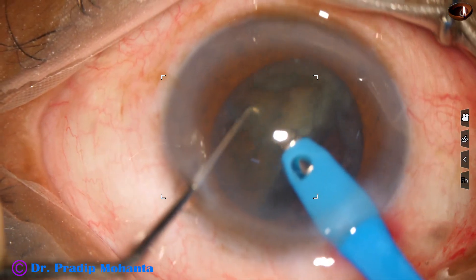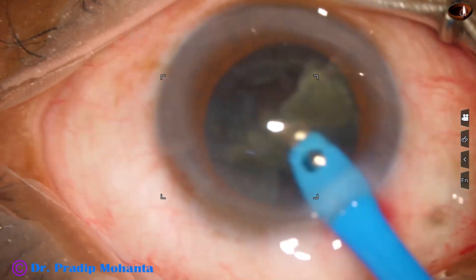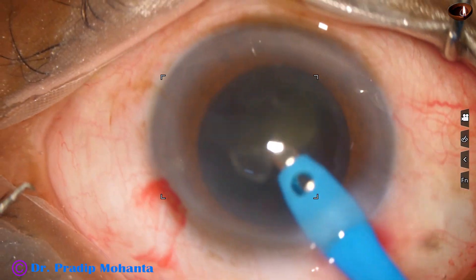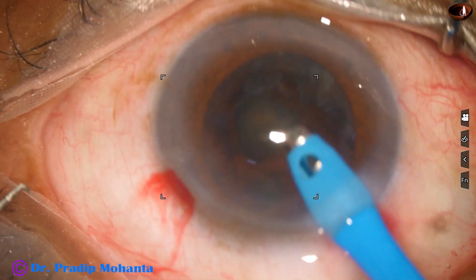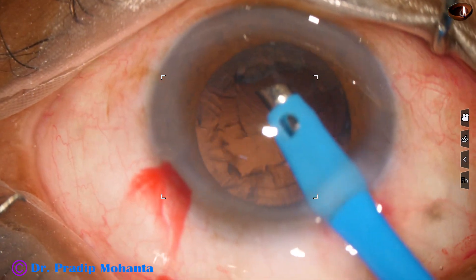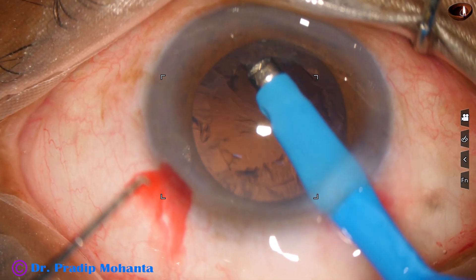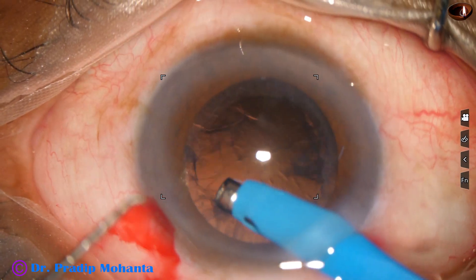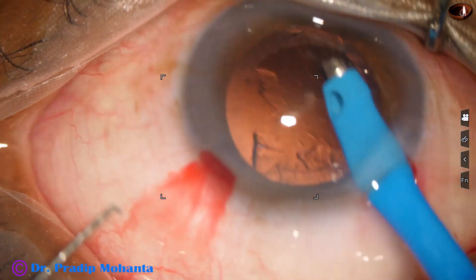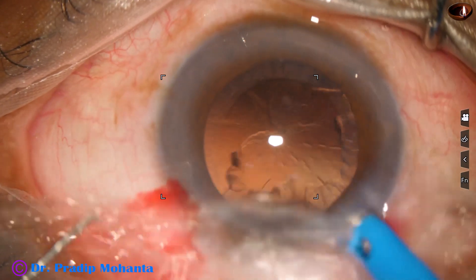Now I come to the intact hemi-nucleus and chop it into 2 pieces. This nuclear fragment has been emulsified, and then the last piece. The chopper has been removed. It keeps a more stable anterior chamber because there is no leakage from the side port. Do not try this if you are a new surgeon — aspiration of some cortex with the phaco needle. If you are having a lot of experience, then you can try this.